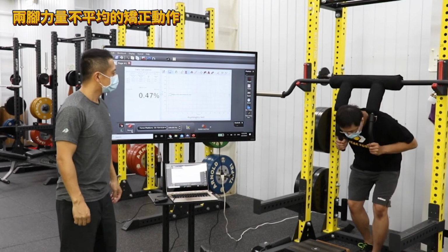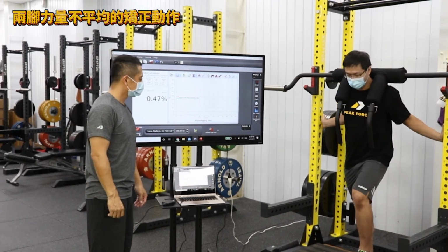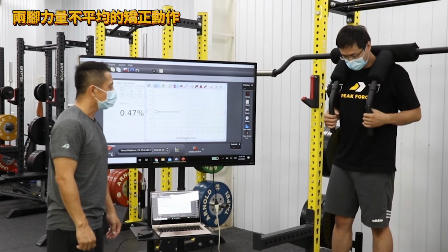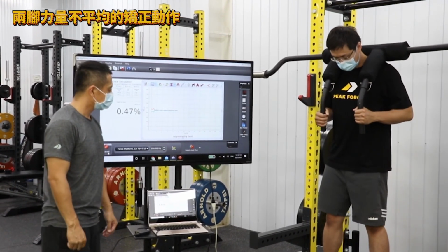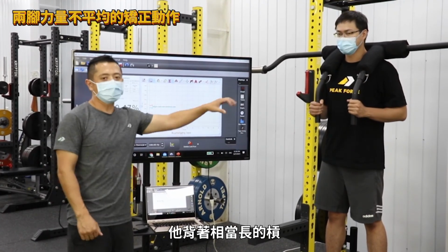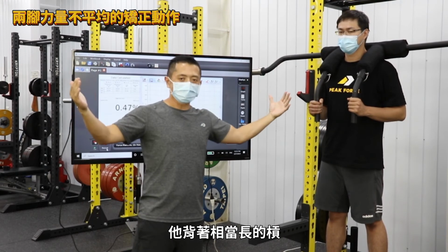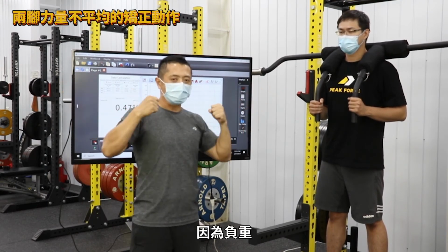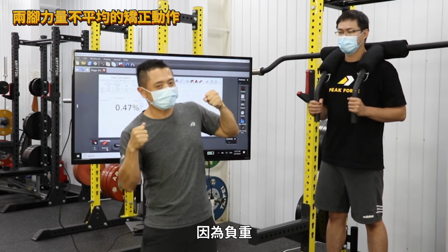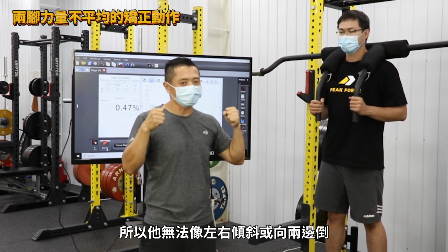好，那现在呢，我会用这个安全杠的部分做这个深蹲，然后会在这个测力板上做。那大家可以去注意到我们在测力板上的数值是如何。So what I'm setting up here for him is he's gonna have a barbell, pretty long, so he cannot actually tilt this way. He cannot tilt side by side because it's heavy.